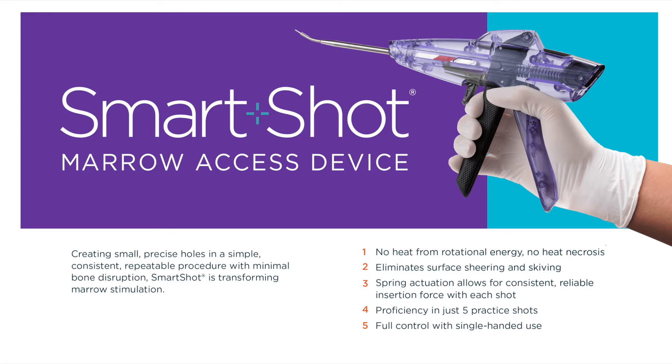Unlike power drills, SmartShot provides no rotational energy or heat necrosis. SmartShot eliminates surface shearing and skiving, and its spring actuation allows for consistent, reliable insertion force with each shot. It only takes a few shots to be proficient with single-handed use.